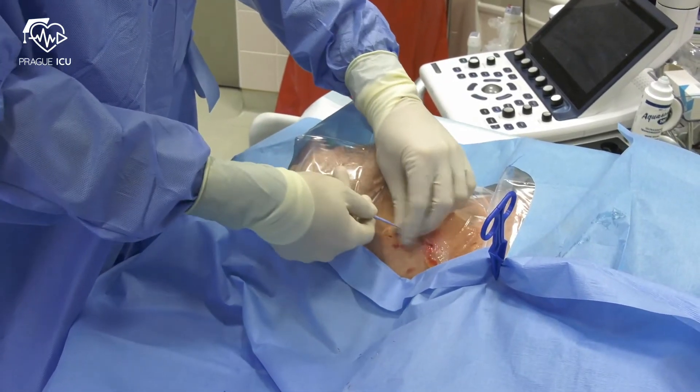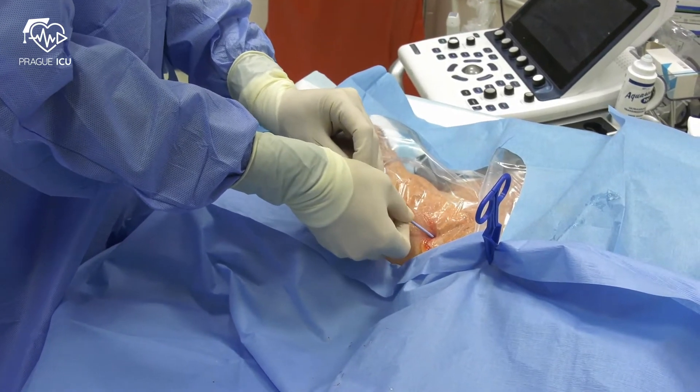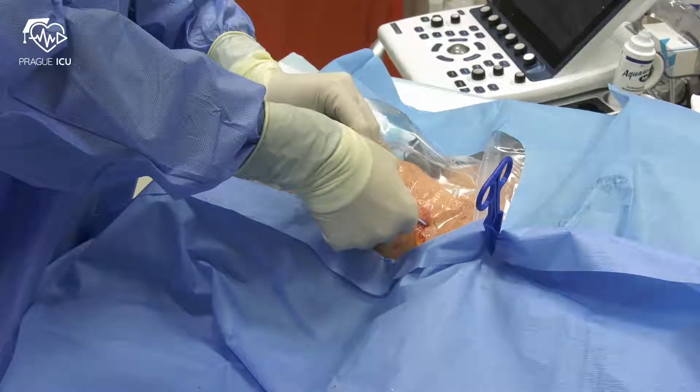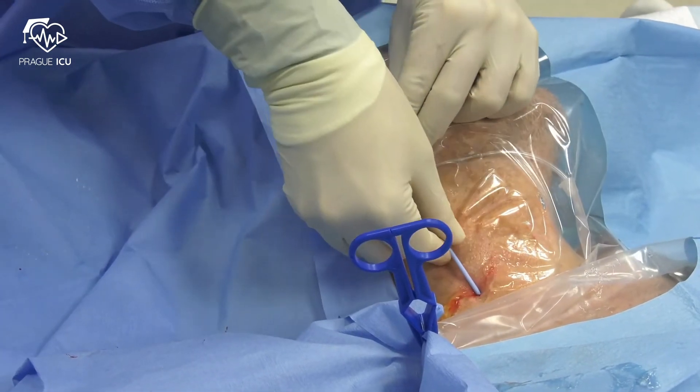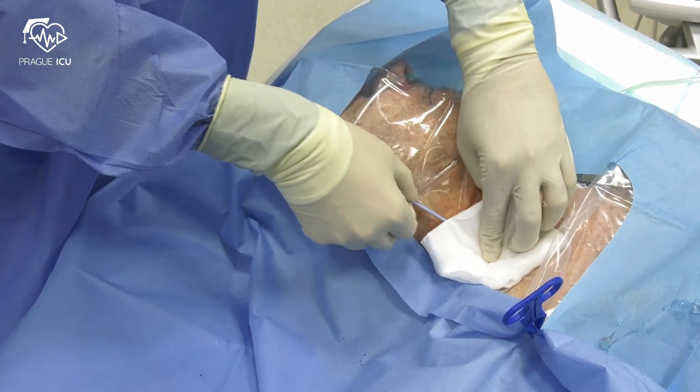Make a small superficial incision at the entry point of the wire to facilitate the passage of the dilator. Insert the dilator using a rotating motion. Avoid bending or kinking of the wire.